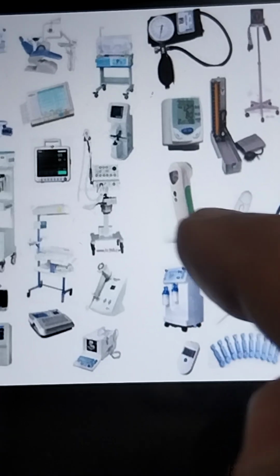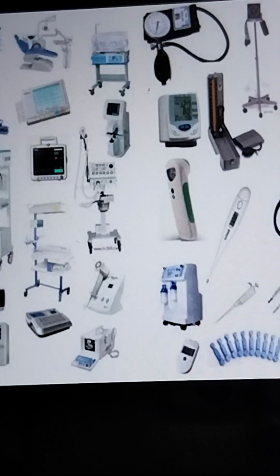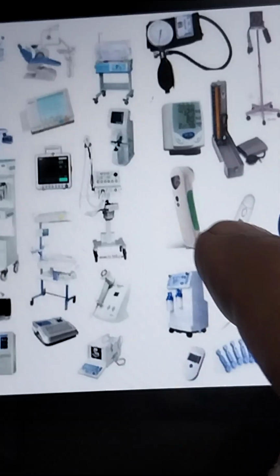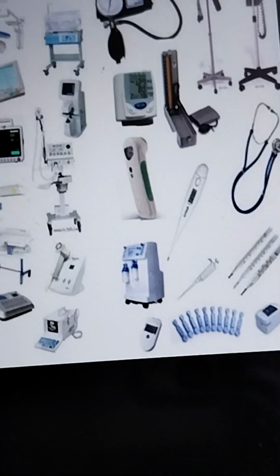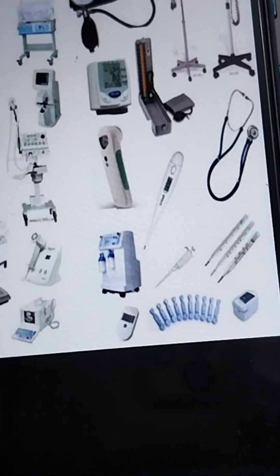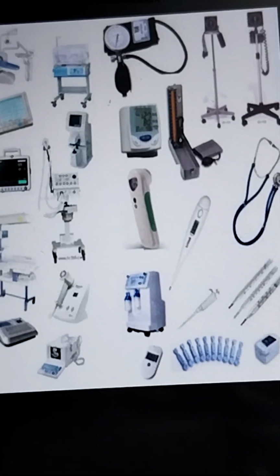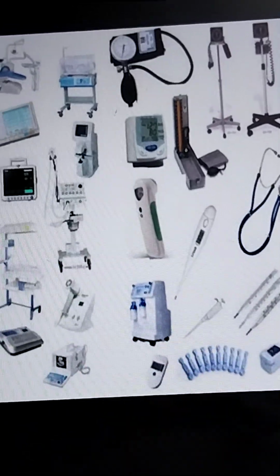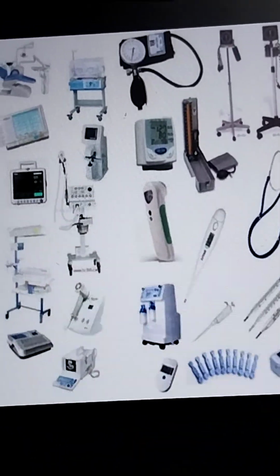Uncalibrated medical electrical equipment can present a range of hazards to the patient, to the user, or to service personnel. Many such hazards are common to many or all types of medical electrical equipment, while others are peculiar to a particular category of equipment. While we shall discuss the benefits of calibration, let us first discuss the hazards.